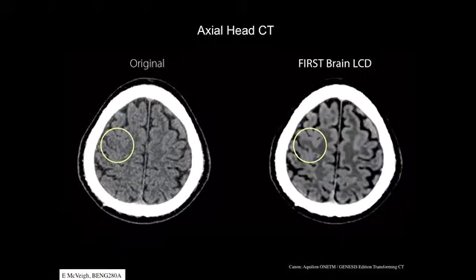So what's all the excitement about? Here's an example CT image of somebody's head. And let's look at this one on your right. As you can see, the components of the brain are generating different contrast or different intensities.